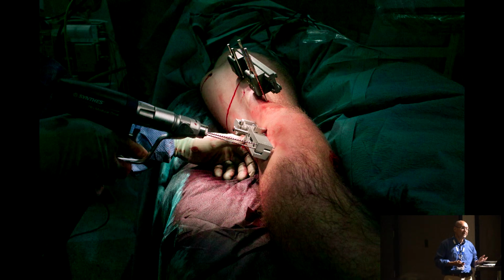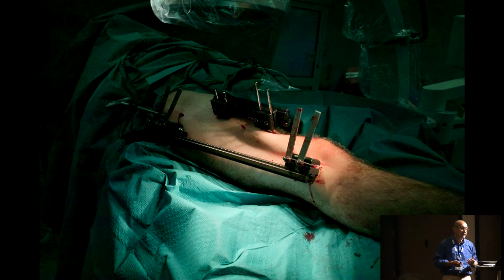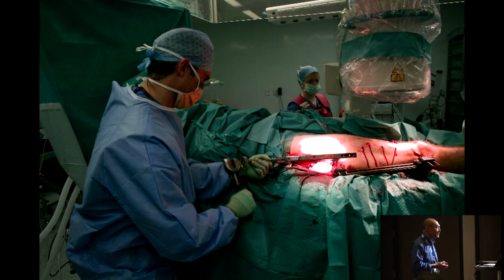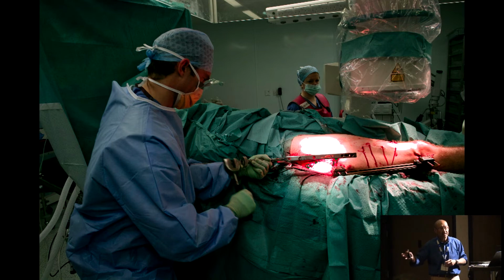What's the caveat? When you've achieved the correction, you take off the anterior rail because you've already achieved the derotation and just leave the coronal plane rail down, and that allows you to achieve the correction over an intramedullary nail. And you'll notice, because the rail is posterior to the intramedullary nail, you can lock proximally and distally while the rail fixator is still on.